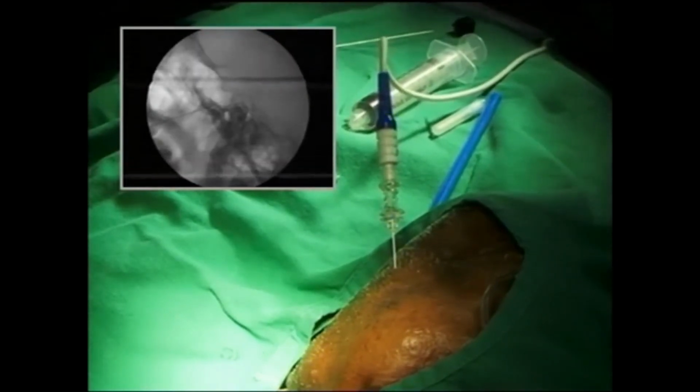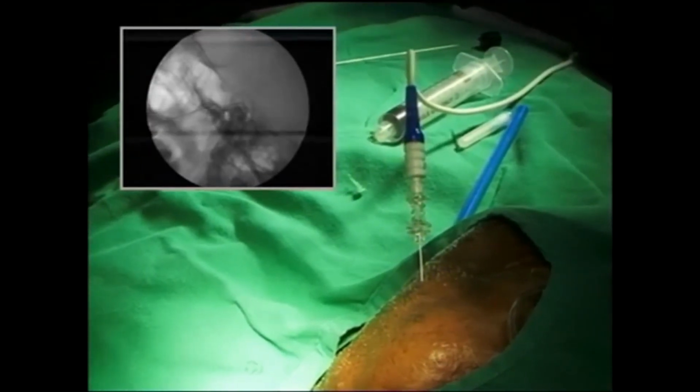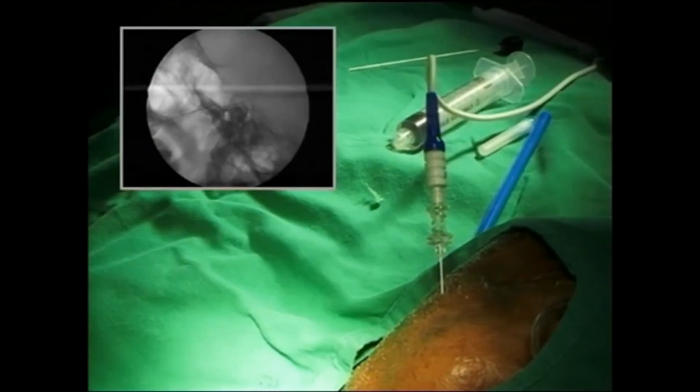So you are doing motor stimulation? I'm going to do sensory first now. Sensory, okay. Ask him if he's getting a shock.